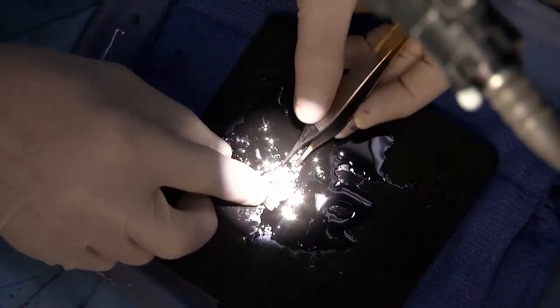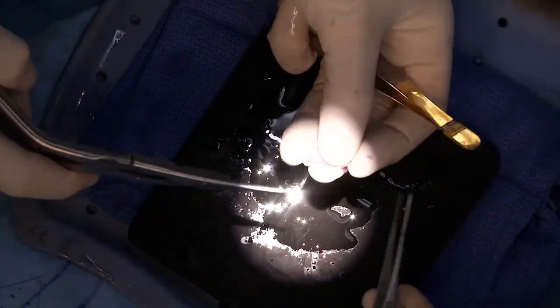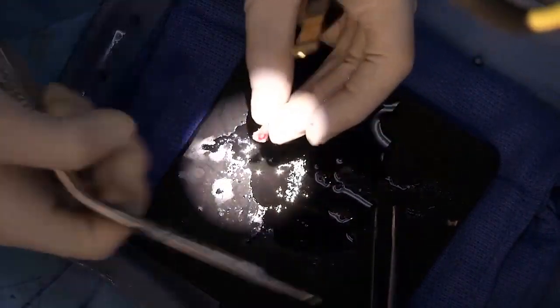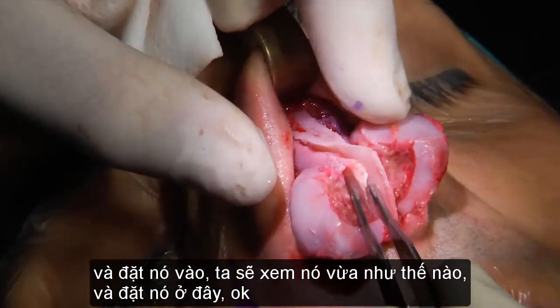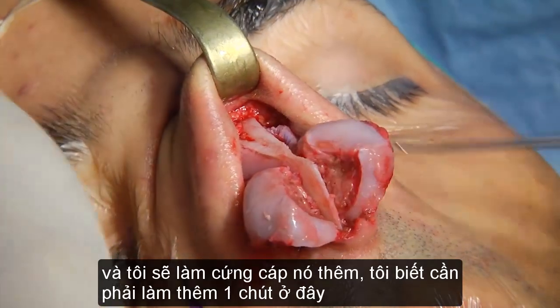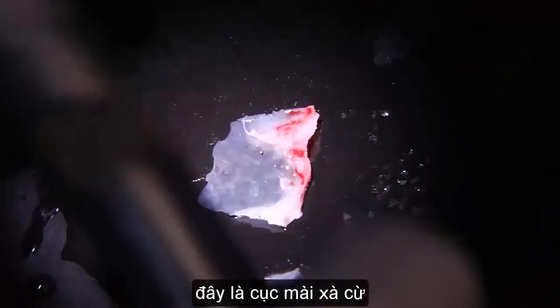So this is not much. Give me the bone scissors. But I will use it. Bone scissors. Ready the Gubisch burr. So my plan here is to perforate this thing and put it, let me just see if it fits, and put it here, all right? So I will strengthen it to some degree. I know it needs a little bit of work here. I have some residual cartilage here. Okay, this is the burr I used, which is Wolfgang's burr.